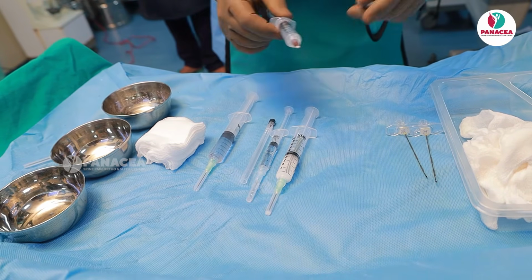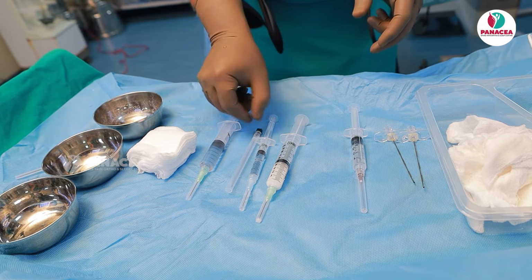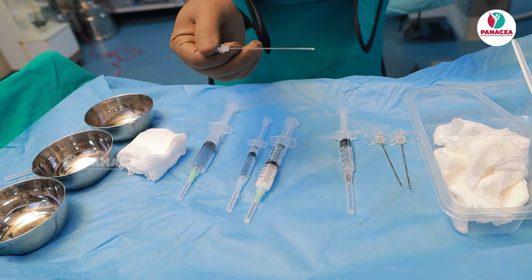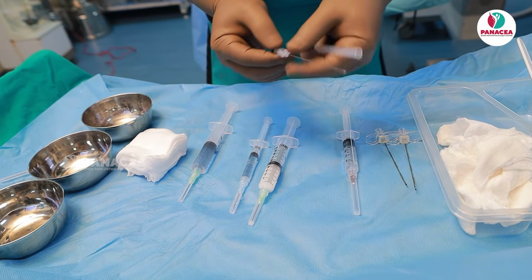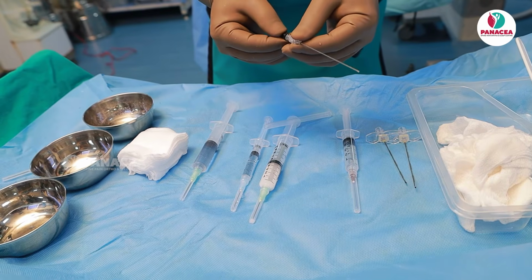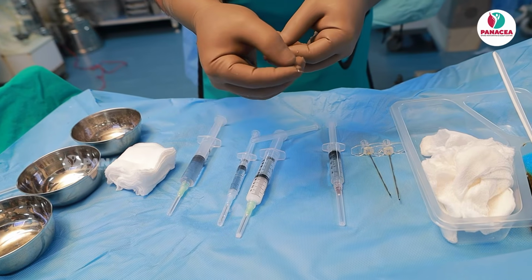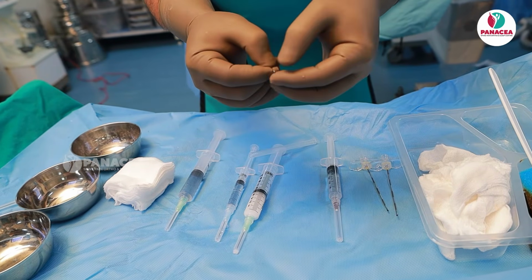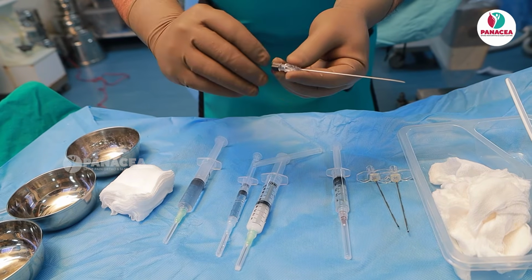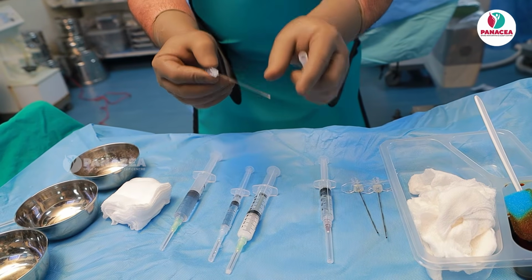You see here, this is a 26 gauge hypodermic needle, and here comes the needle. The procedure is done with the help of a 22 gauge Quincke's needle. We are going to do it in coaxial view. You look here, there is a slot, so the needle is beveled down, and we are bending the needle tip to the opposite side of the slot. Look here, the slot is up, so I bend it down. I will tell you the advantage of bending the tip.